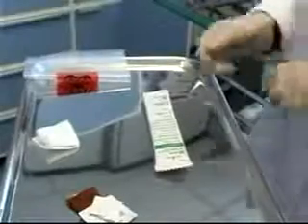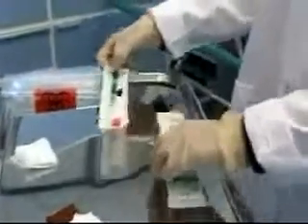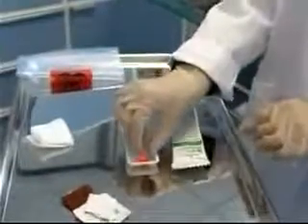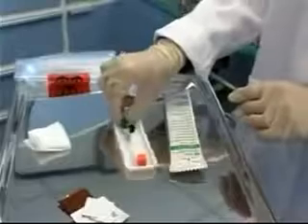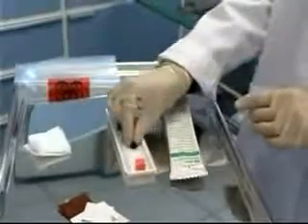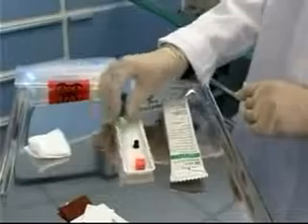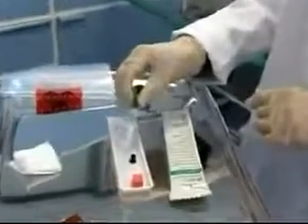While I'm waiting for the skin prep to dry, I can open my blood gas kit. The kit is made up of three different pieces: first, an orange air ball which I'll use to expel any excess air from the syringe; a black cap to go over the syringe for transport to the lab; and a three cc heparinized syringe with a needle attached.